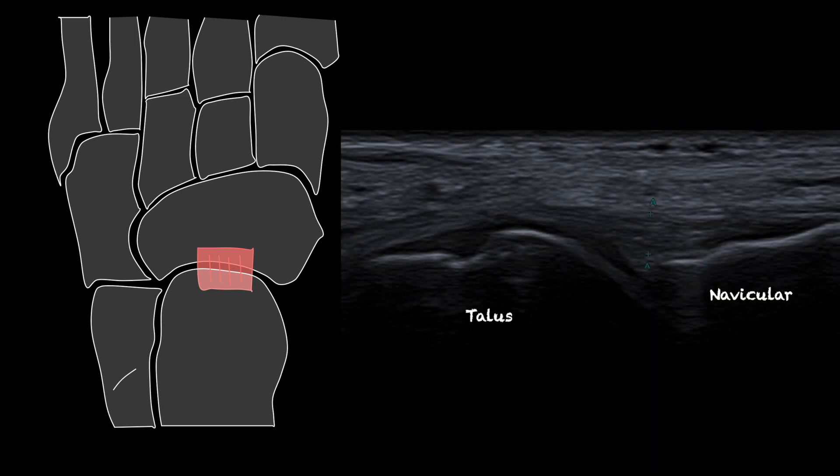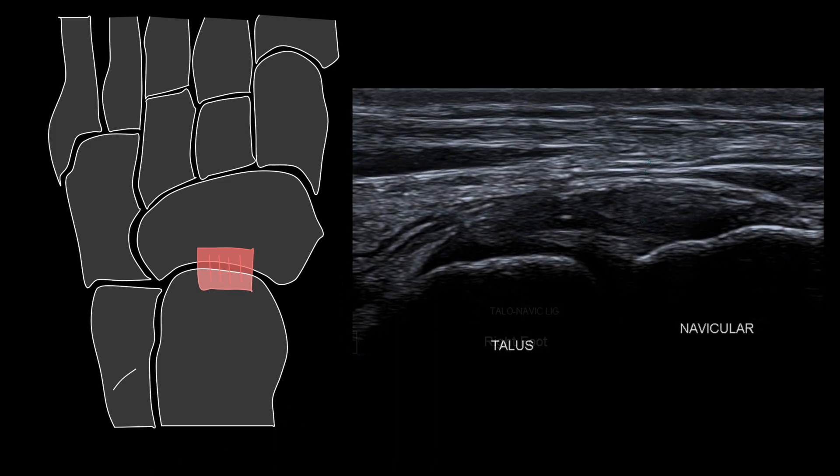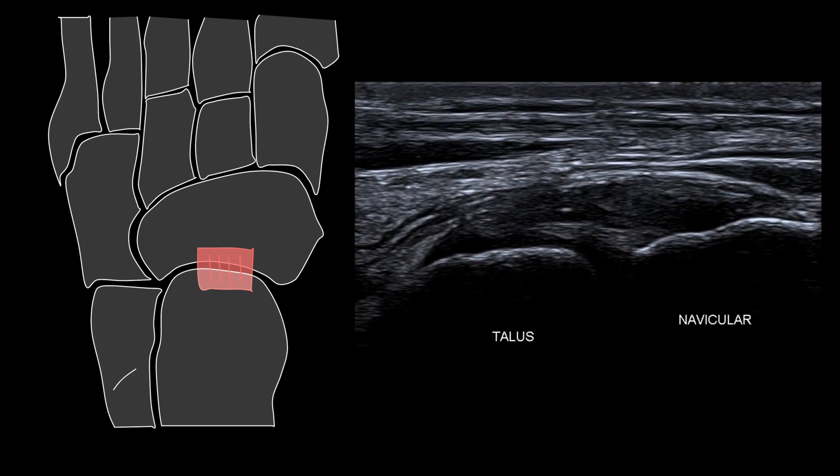Ultrasound lends itself to comprehensive assessment of this ligament. We can easily identify a normal ligament and a torn talonavicular ligament.